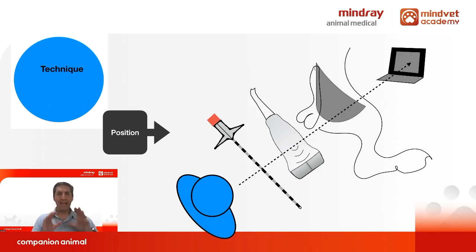So I can see all the scenario without moving my head. I can see every single thing: my hands, the needle, the probe, how the needle aligns with the probe in order to see the needle in the screen, and the screen itself, just moving the globe of my eyes.